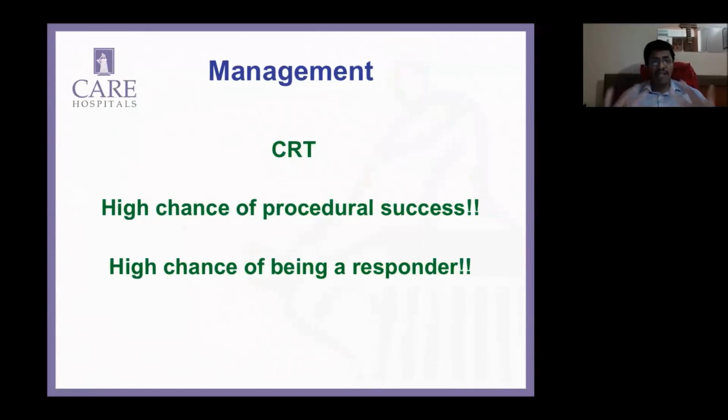So just the additive use of CTA in these patients, where you're going to get wall motion, you're going to get some element of dyssynchrony, and you're going to get scarring. We're seeing scarring on CTA. I already showed you data on scarring. Most importantly, you're going to get the coronaries because you really want to rule out CAD, especially in that subset.